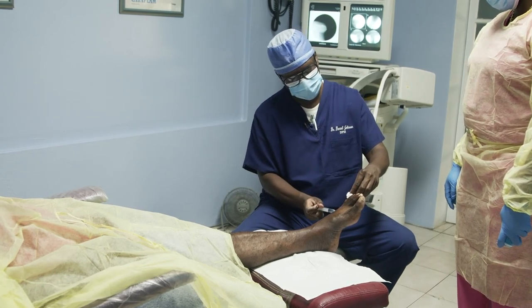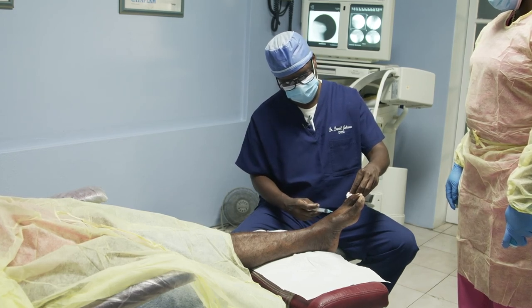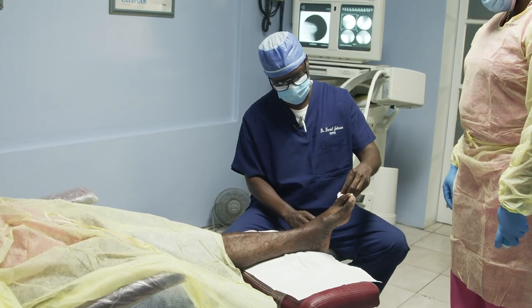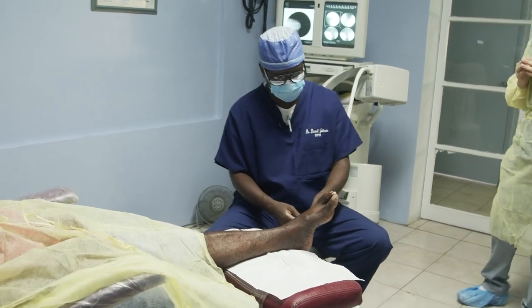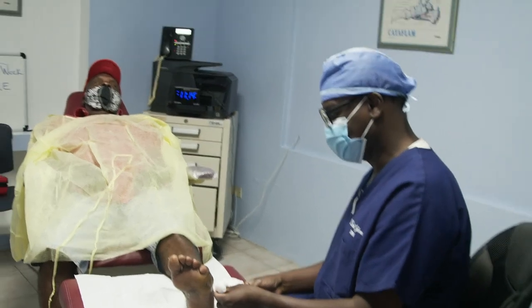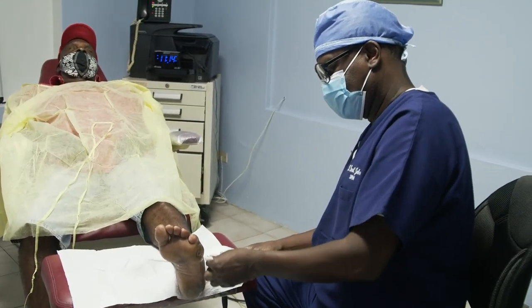Okay, so we're underneath the metatarsal, right beside the joint. Coming out on our side, and then we'll put a little bit where we want to do our incision. And I'm going to leave that there. Give me a straight artery forceps. You jerk this in kind of tight. So I want to open this. Oh, I got it. Okay.